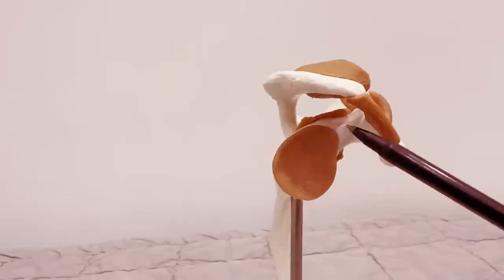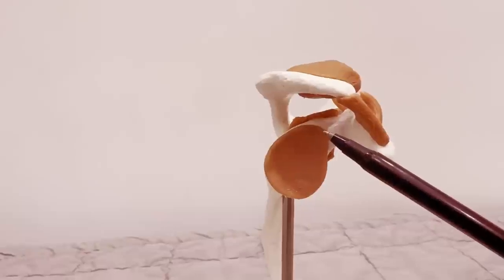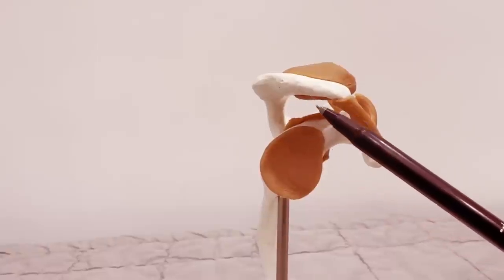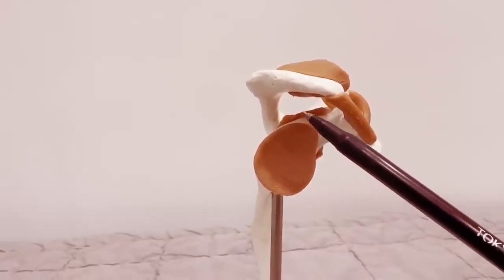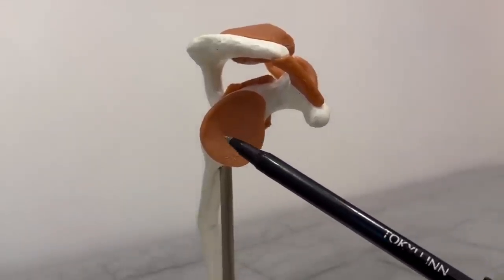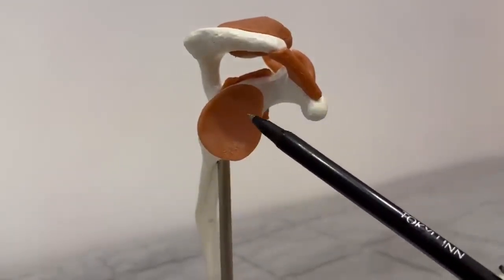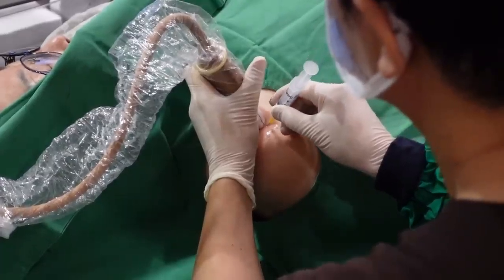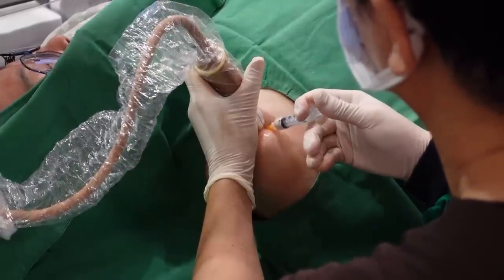This round area is the scapular glenoid joint surface. Here are the 12 o'clock and 3 o'clock positions of the articular surface. This area is for the supraspinatus tendon and the superior edge of the bony scapular glenoid. Here is the coracoid process. This area provides the attachment sites of the coracohumeral ligament, which are the first targets for adhesive capsulitis. My needle is directed to the posterior superior aspect of the coracoid process to approach the coracohumeral ligament.